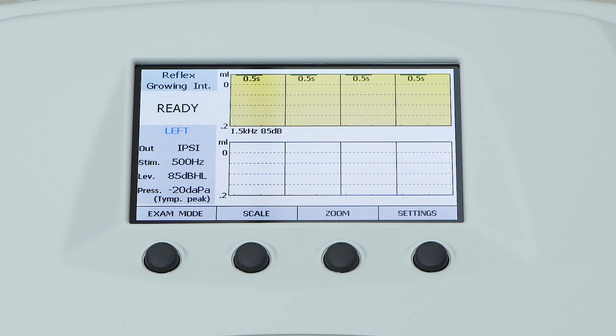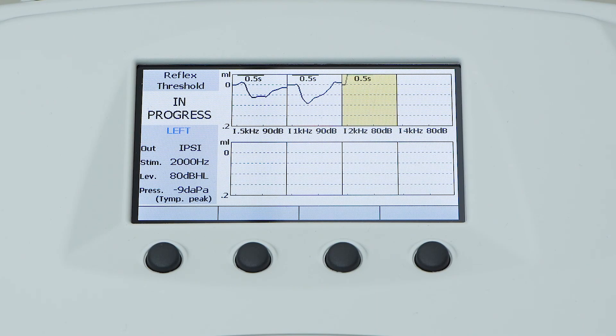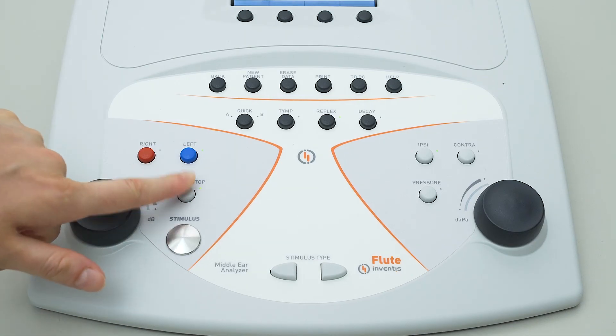In fixed intensity mode, each stimulus box will be tested only once at the selected intensity. In threshold mode, each box will be tested until the reflex contraction is detected. In growing intensity mode, the reflex variation in amplitude can be analyzed in relation to the increase in stimulus intensity. If the examination is interrupted due to a lack of pressure or because an open or closed status of the probe is detected, the sequence can be restarted from the last box examined by simply pressing the start button again.